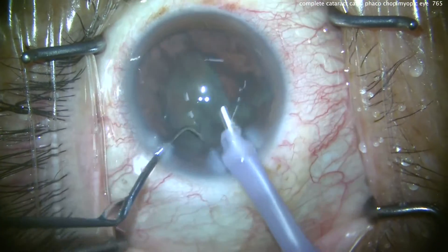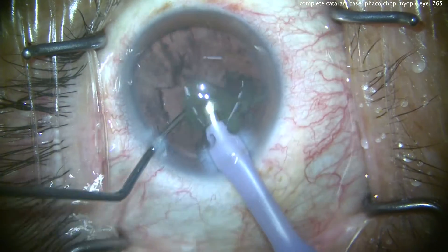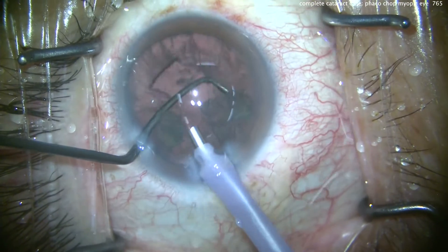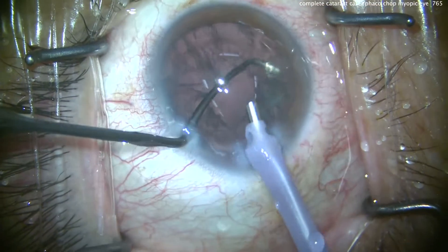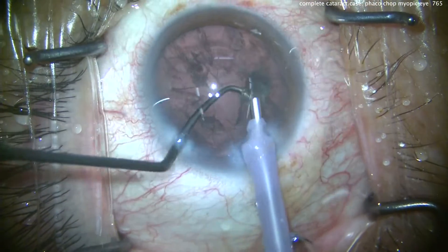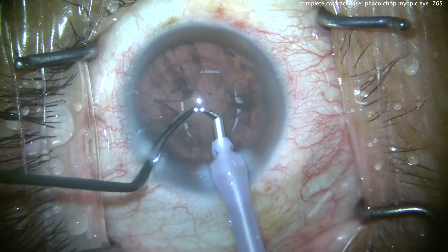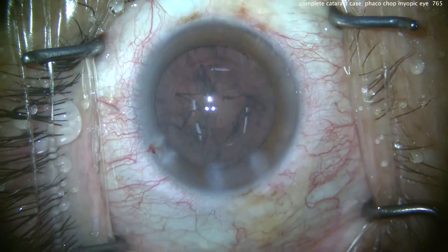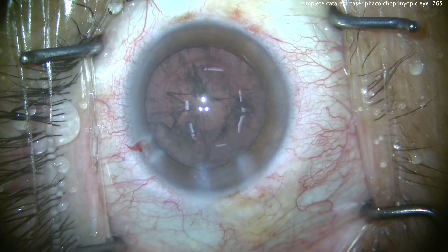The second half comes up — chop it again and we can emulsify it. Now be very careful here. When the last pieces come up, look what the chopper's doing — protecting the posterior capsule. In an eye that's very myopic, a broken posterior capsule can mean a much higher risk of a retinal detachment. We want to avoid that. Nucleus is out. We didn't let the anterior chamber collapse either.